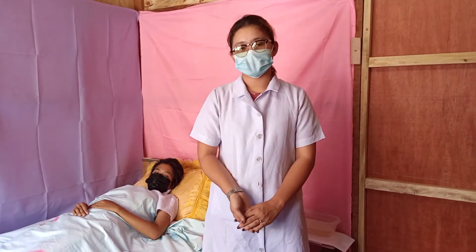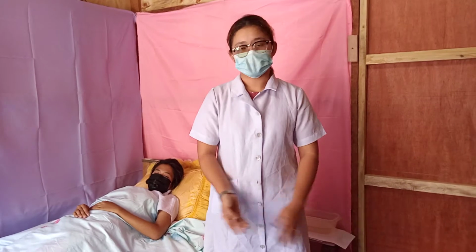Next procedure, assemble the equipment. Rationale: to promote the efficiency of the healthcare provider.